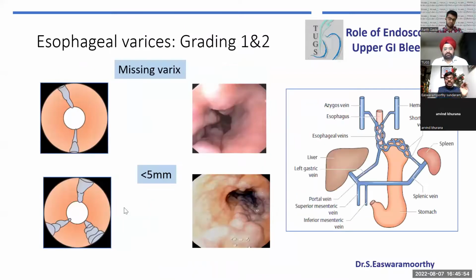Coming to these smaller varices, sometimes they may be innocent bystanders. The actual bleeder may be down below, like fundal varices or some other cause, to be frank. But if they do bleed, especially one or two residual varices because of high portal pressure, sometimes you can give sclerotherapy. Glue is preferable, or you can use various sclero agents that are available. But take it from me, sclerotherapy is now slowly coming off because of good banding.